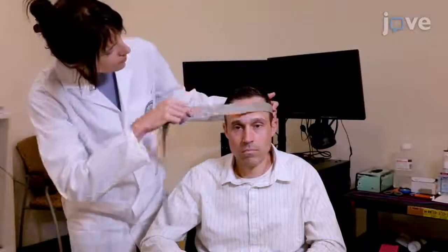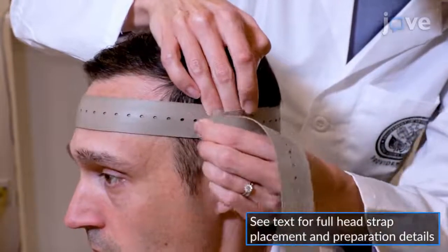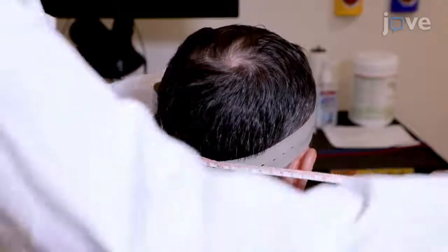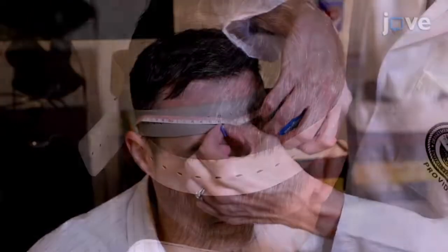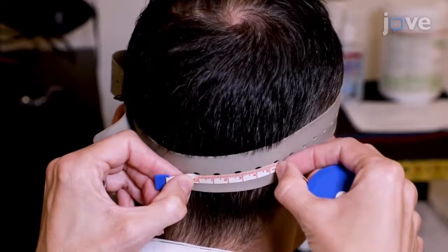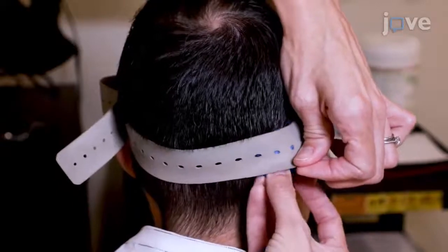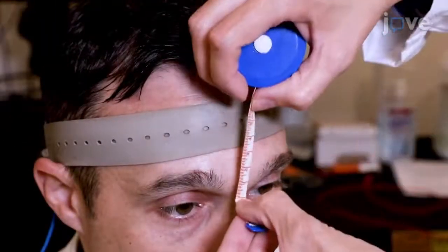To prepare a participant for transcranial direct current stimulation, after placing the head strap on the participant, stand behind the participant to establish the location for the cathodal electrode using the previously calculated 10% of head circumference, and measure this distance out from the end of the head to the right. Place the cathodal electrode according to the measurements such that it is approximately behind the right ear on the mastoid process.